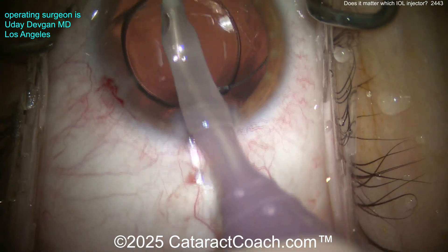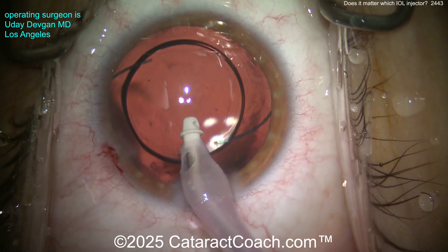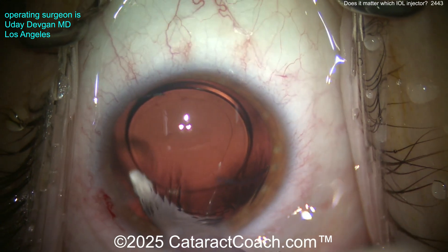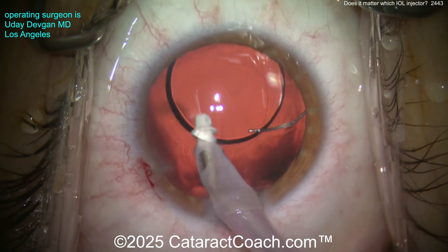At the end of the case, look at that beautiful overlap of the optic by the rhexis — aren't you glad we measured it? Looks pretty good. Keep the lens nicely centered, remove the viscoelastic, and we're ready to finish up this case.